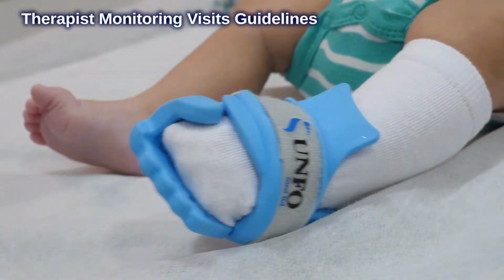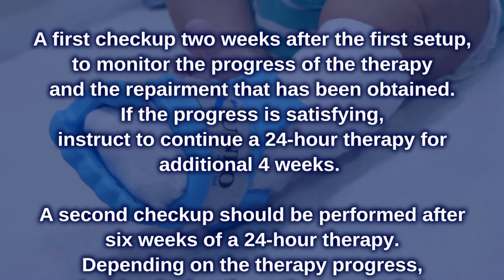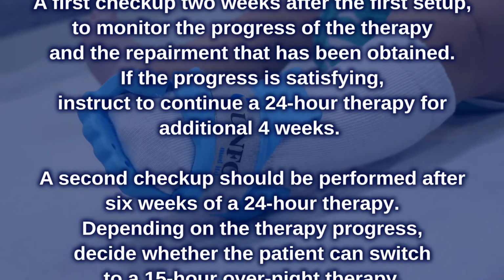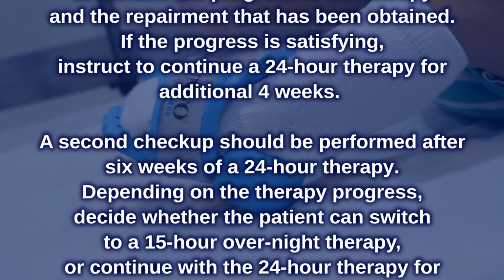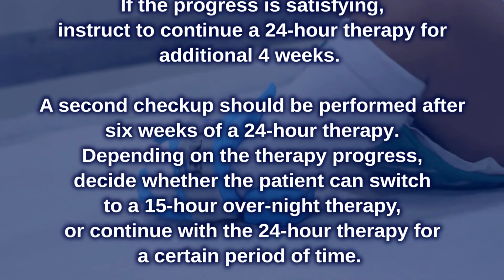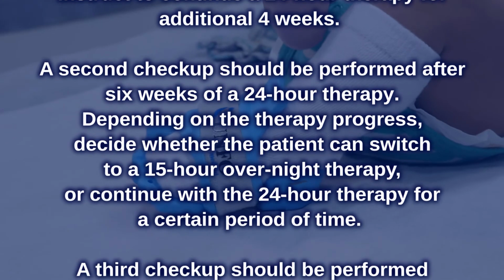It is recommended to get a first checkup 2 weeks after the first setup to monitor the progress of the therapy and the repairment that has been obtained. If the progress is satisfying, instruct to continue a 24-hour therapy for additional 4 weeks. A second checkup should be performed after 6 weeks of a 24-hour therapy.